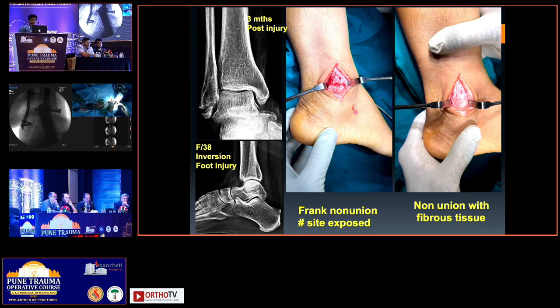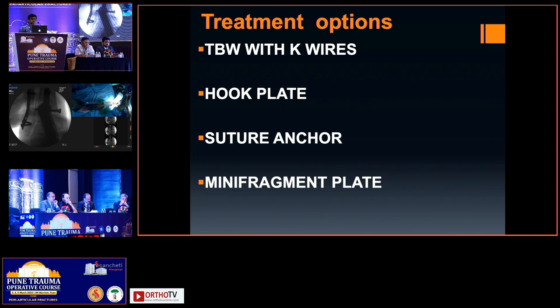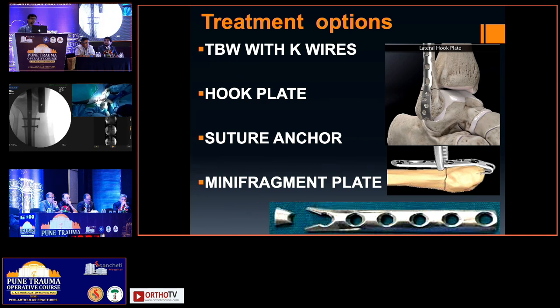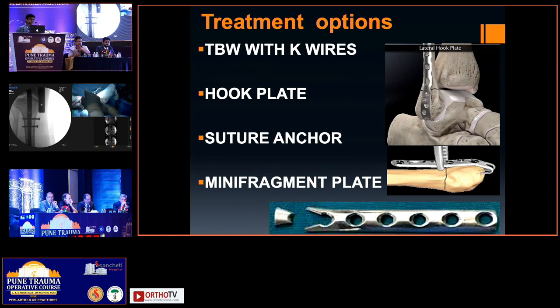So now, options of fixation: either a tension band with K-wires, hook plate, suture anchor, or mini fragment plate. So these are the implant options available. That small hook plate is not available with me yet. We can convert this 1/3 plate into a hook plate like this, indigenously, cut two ends and make the hole and curve it. But the thing was, the fragment was very small. Jignesh, let's wait here for a second.